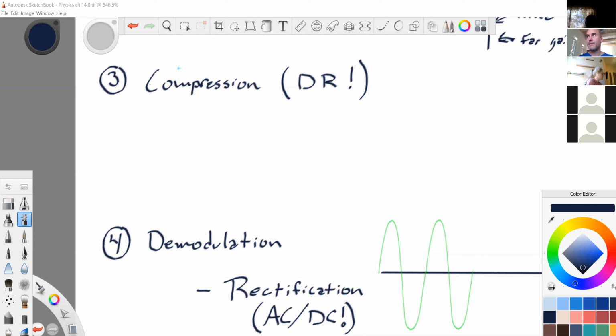I disagree, but I'm not going to belabor that point. But when I'm doing certain exams where I don't care about the texture of the tissue, I'm more concerned about, is there blood flow? Is there not blood flow? In that case, I usually turn my dynamic range down because I like to see a little more contrast between the brighter tissue and the darker blood vessels. So that's how I personally use dynamic range.